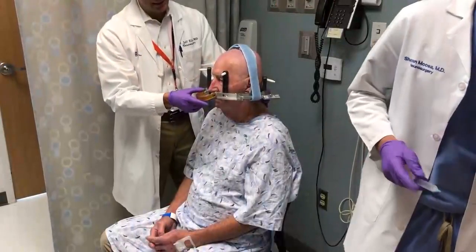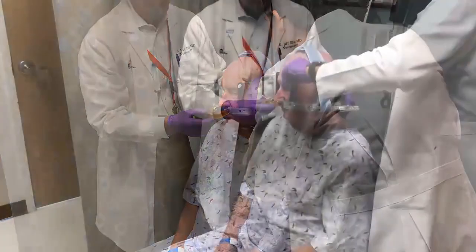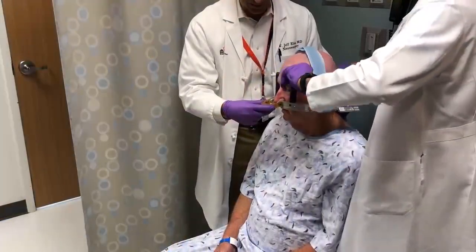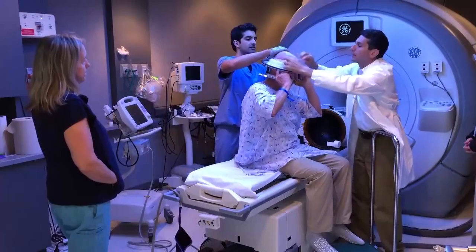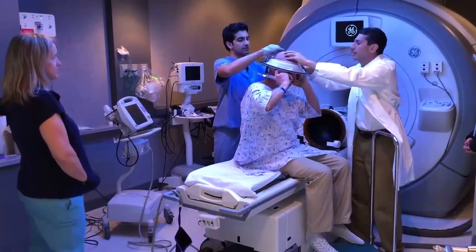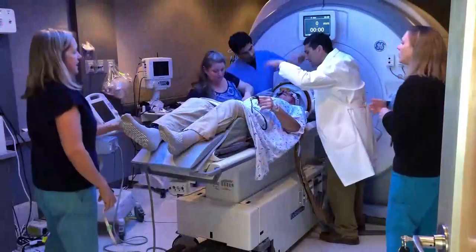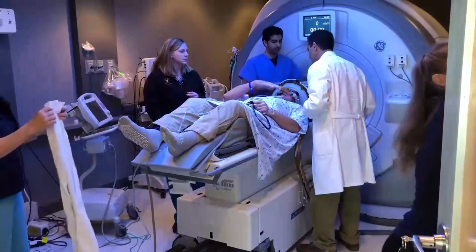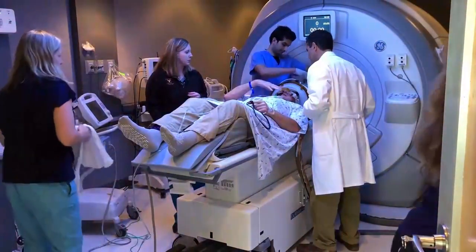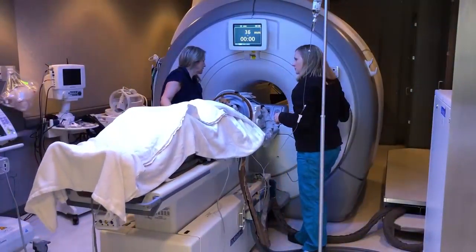A stereotactic frame is placed as low as possible near the orbital rim and parieto-occipital junction in order to maximize the skull surface area available for transcranial sonication. Once the patient is in the MRI room, a silicone membrane is affixed to the scalp and positioned low over the pins. The head frame is then secured to the MRI table, and the silicone membrane is attached to the focused ultrasound transducer. Chilled and degassed water is used as a coupling medium for ultrasound transduction and to cool the scalp. After manually aligning the transducer, the patient is positioned inside the bore of the magnet to its isocenter.